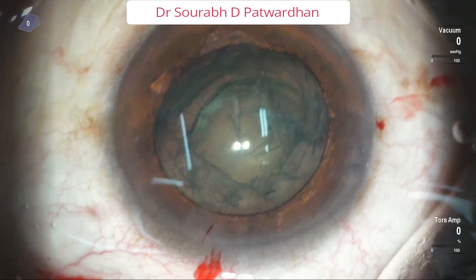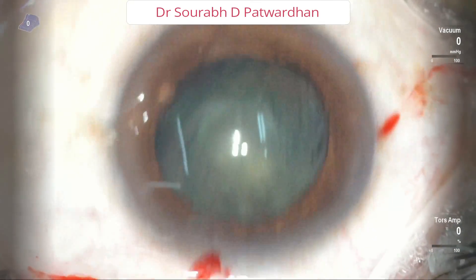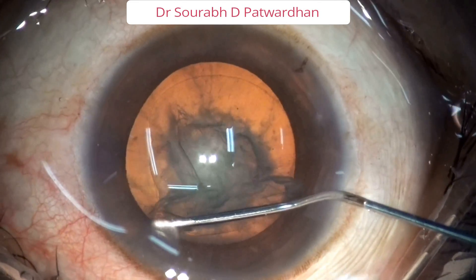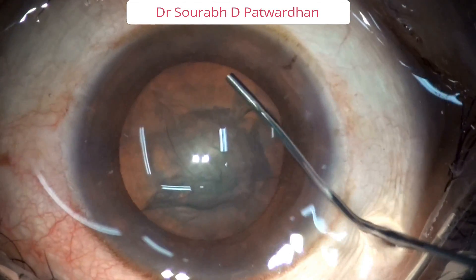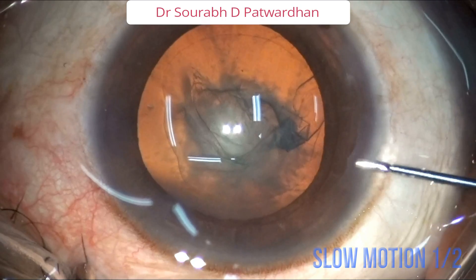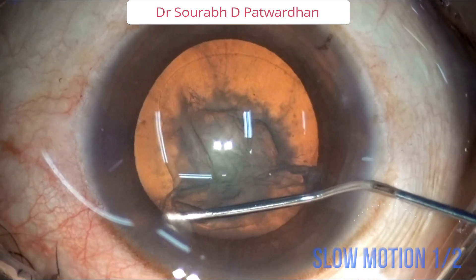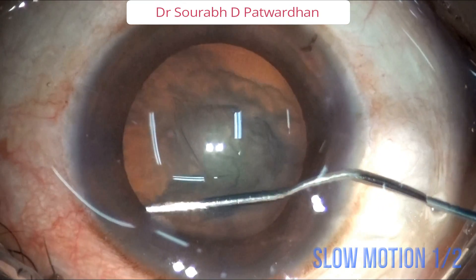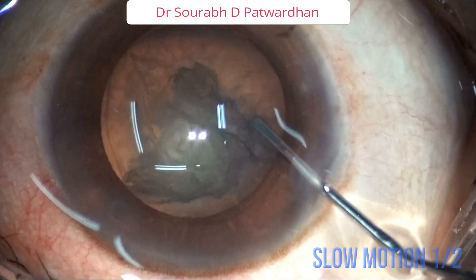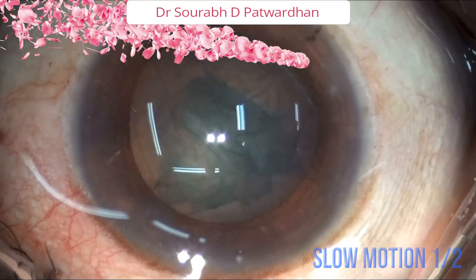Then push viscoelastic, but very little — just to coat the endothelium. Don't push so much that the nucleus tends to go into the back. This is another case showing how to do the nucleus prolapse. So after the first hydrodissection, I gently mechanically manipulated the nucleus so it prolapses into the AC. By prolapse I mean only one pole is prolapsed. Just using the cannula I mechanically lifted the nucleus from one side.